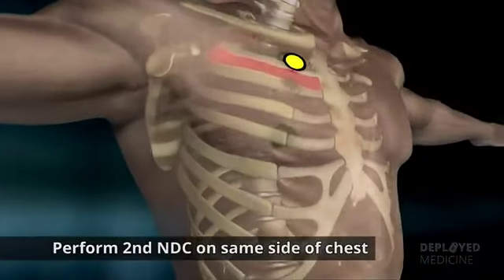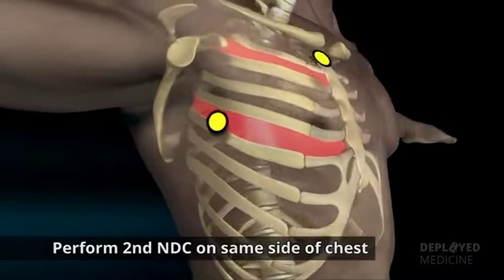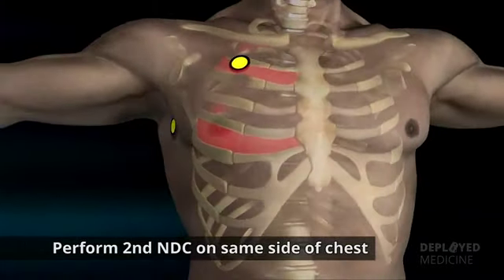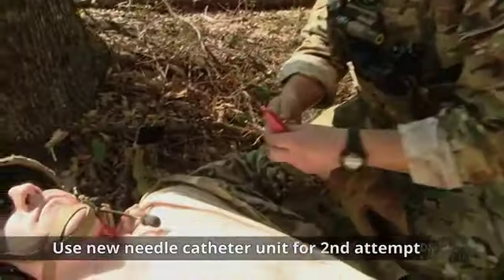If the initial NDC fails to improve the casualty's signs or symptoms from the suspected tension pneumothorax, perform a second NDC on the same side of the chest at whichever of the two recommended sites was not previously used. Use a new needle catheter unit for the second attempt.